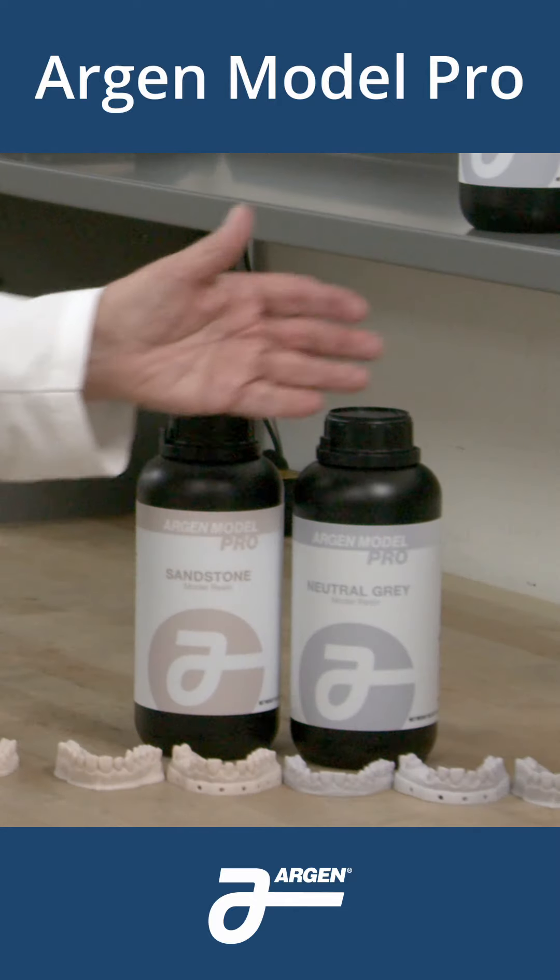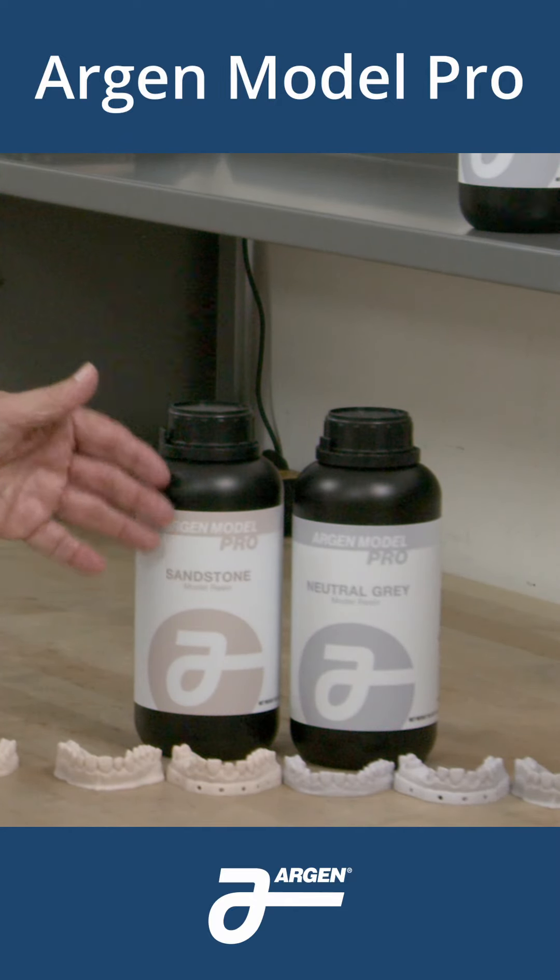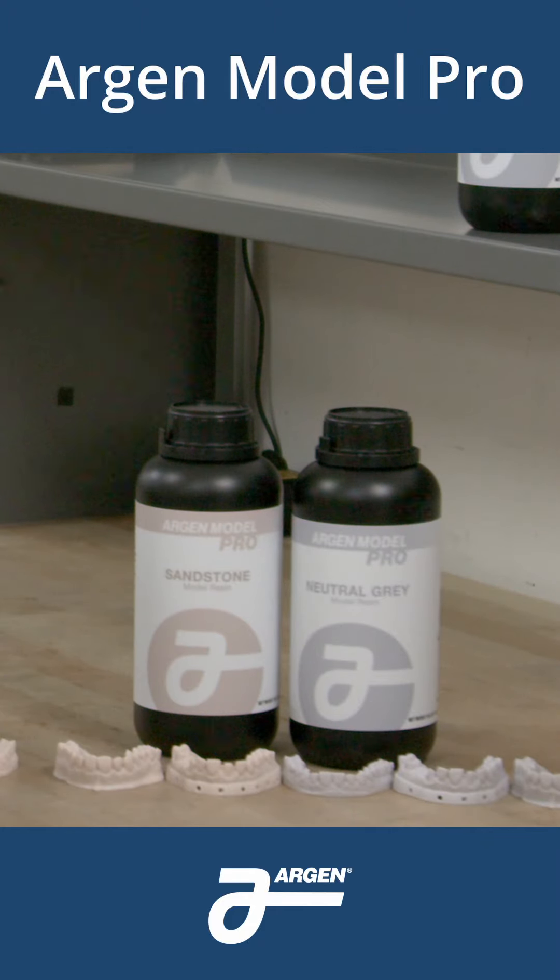It comes in two colors: a neutral gray and a sandstone. Notice the sandstone is not the reddish beige that you're used to seeing.